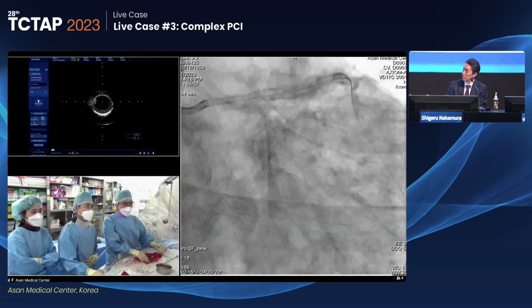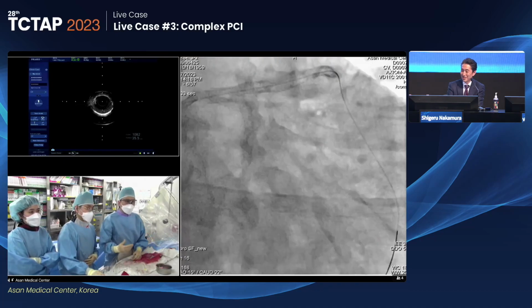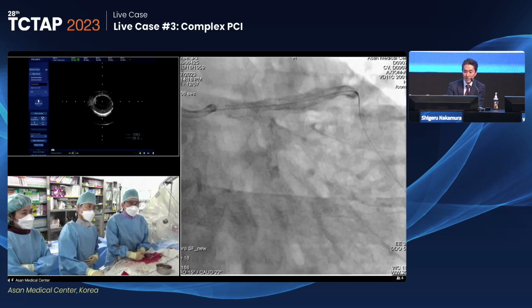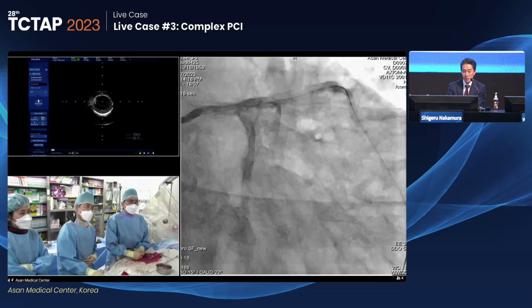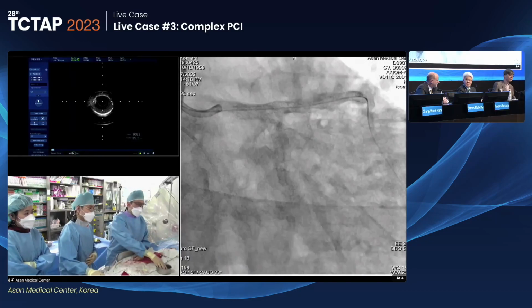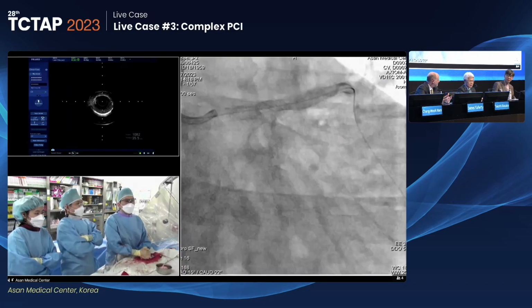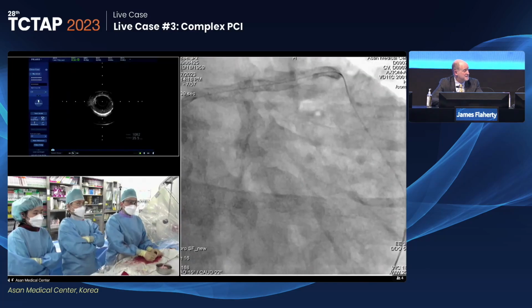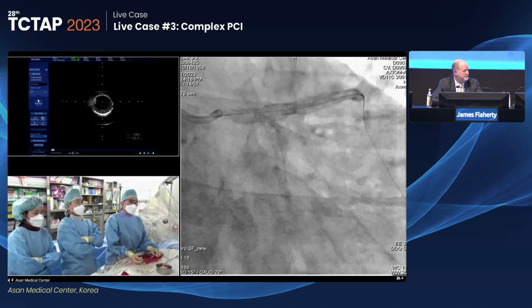Well, this is an age-old debate. Do you perform routine kissing for the left main crossover? For all cases? No, that's the beginning. So in the first case. Yeah, but I believe Dr. Hong told me the Korean data suggests that it leads to more injury than it helps, if the branch is not diseased in the first place. But many hold your opinion. Okay.